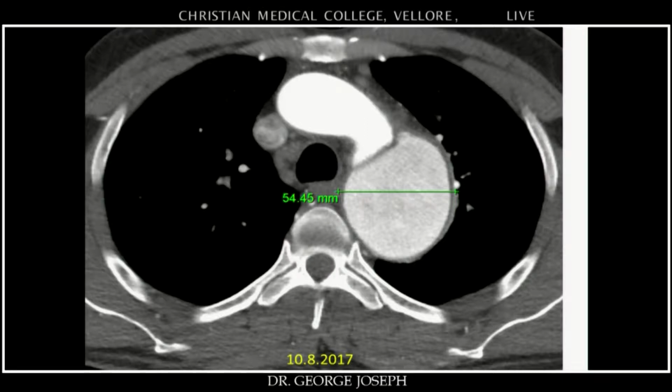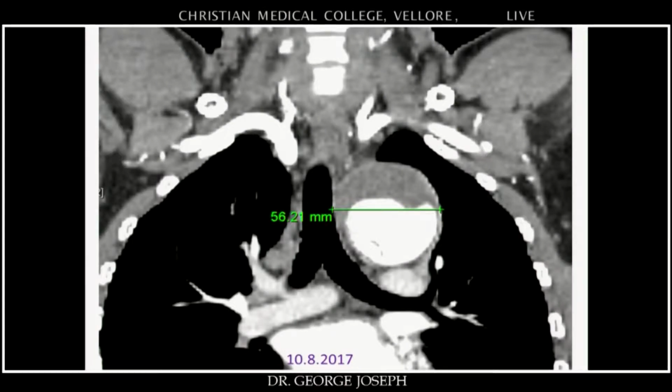It's 54 millimeters in the axial view, and 56 in the coronal view, and you can also see some thrombus lining the false lumen. So there is a progressive growth of the false lumen, and it has crossed 5 centimeters. So given these two points, we feel that it's time to intervene in this patient, even though he remains asymptomatic.